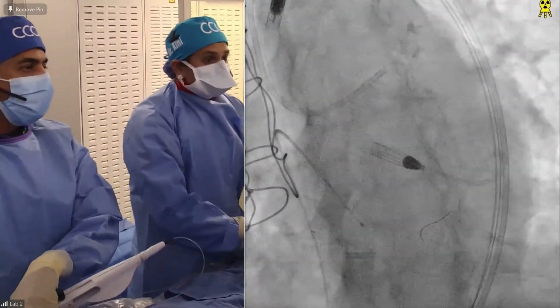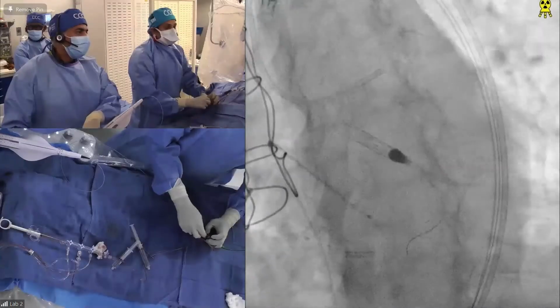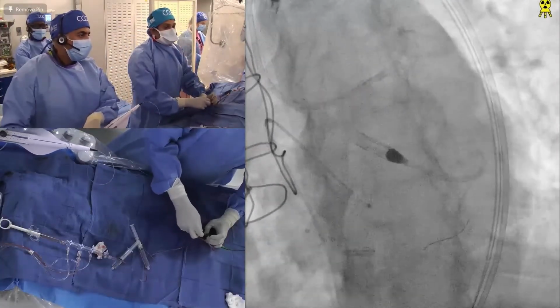So, Dr. O'Neill, what do you think? Going with 1.25? That was pretty good, huh? 1.25, slick. Yeah, that's fantastic. We usually talk about 1.5, but I'll go with the smallest burr available. So the question is the same.